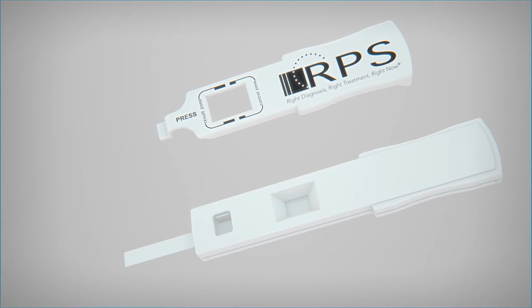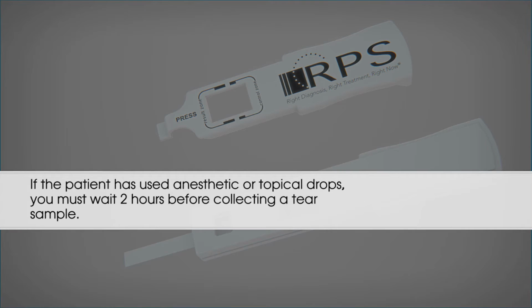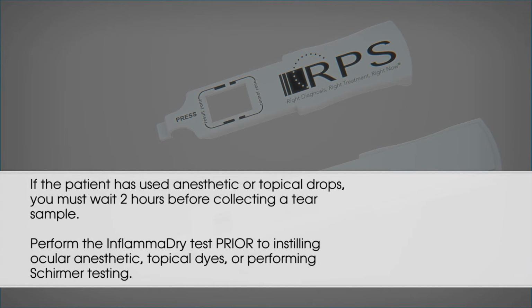Step 1 is collecting the tear sample. If the patient has used anesthetic or topical drops, you must wait 2 hours before collecting a tear sample. Perform the InflammaDry test prior to instilling ocular anesthetic, topical dyes, or performing Schirmer testing.